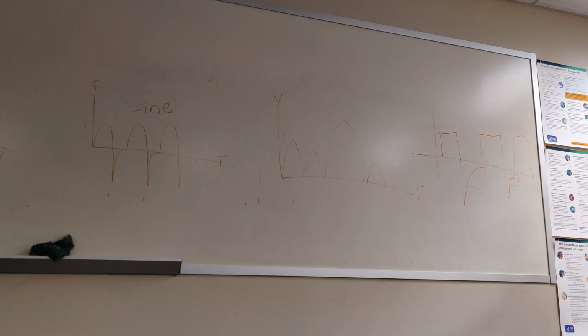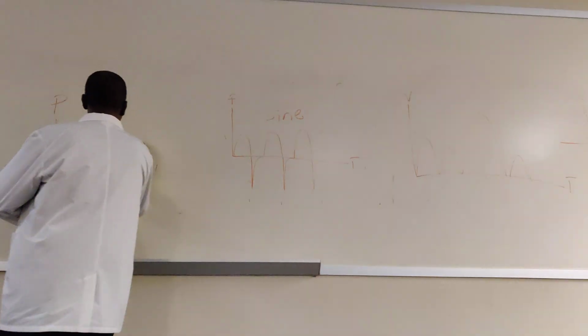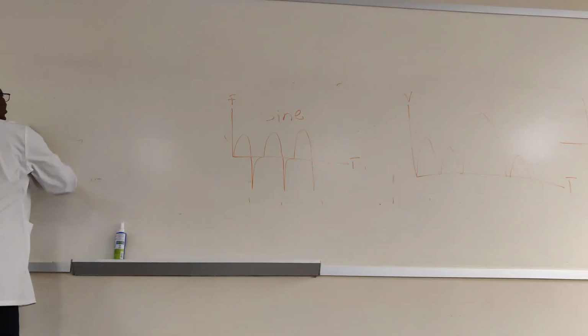On the volume controlled mode, increase the flow, that shortens your I time and lengthens your E time. Or maybe they don't give you that, you decrease the respiratory rate. On the pressure control mode, we don't set flow, so the only choice you really have there is to decrease your respiratory rate. Okay? Any questions about that? All right, let's knock out the other.